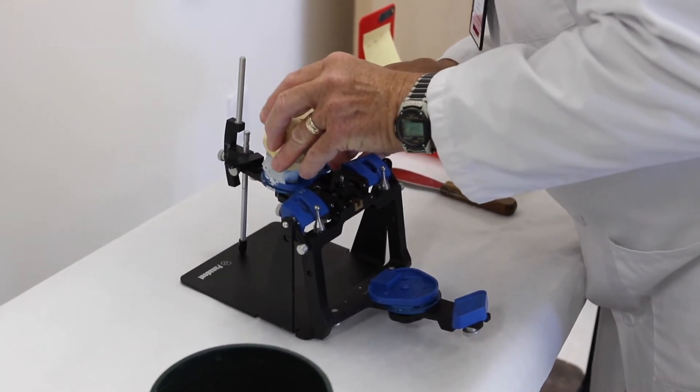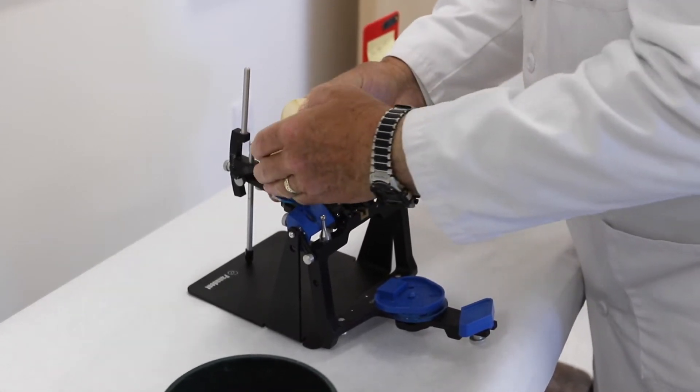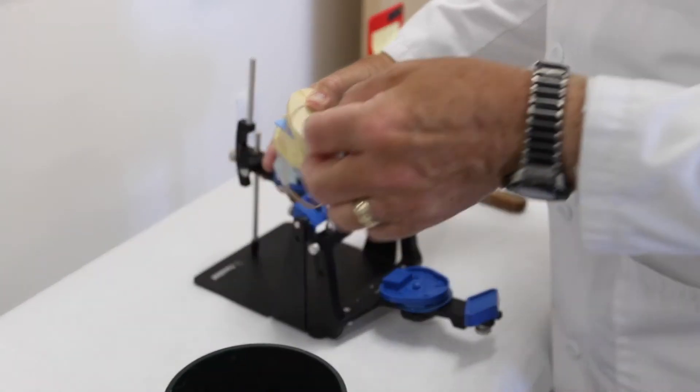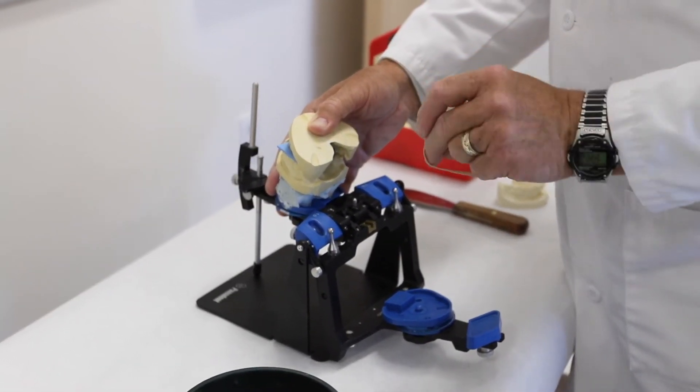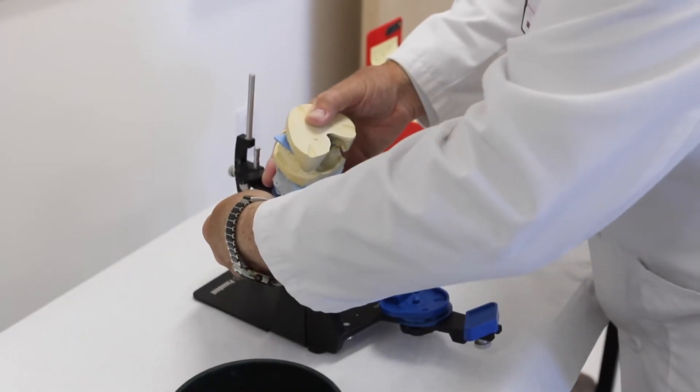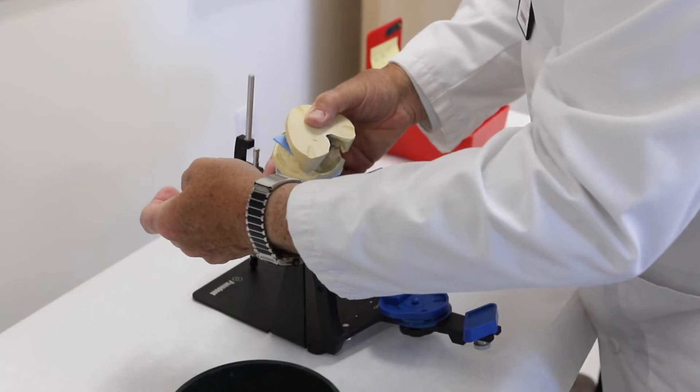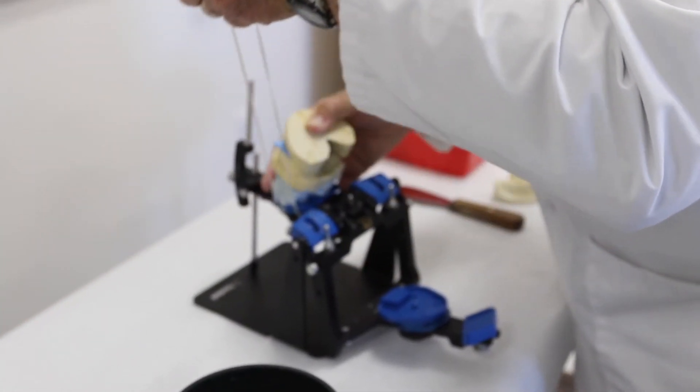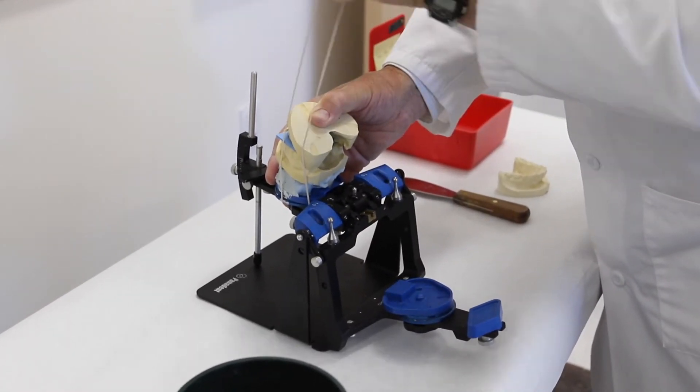So now you've got it set on the maxillary, place the mandibular. Also at this point you get an elastic band and you take it, wrap it around and underneath the main knob on the upper member of the articulator, and you carefully stretch it out and over the mandibular model.